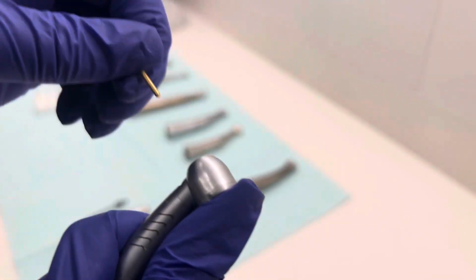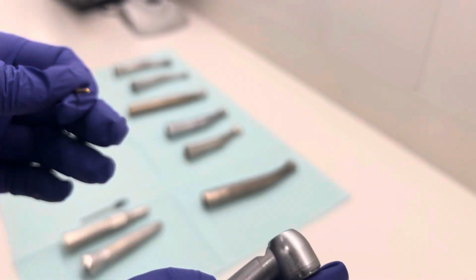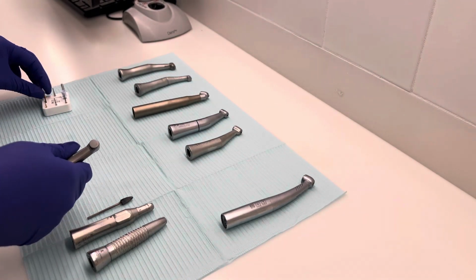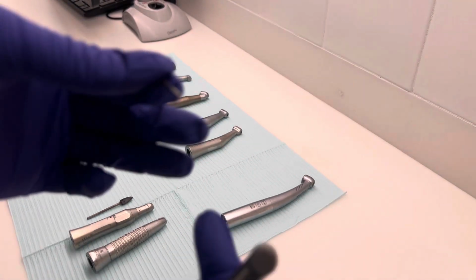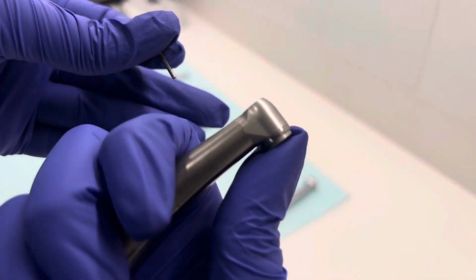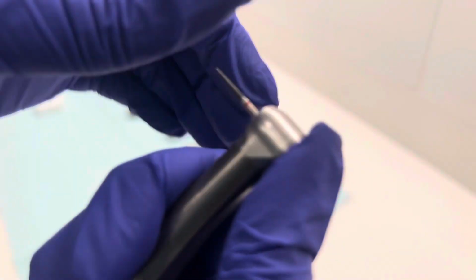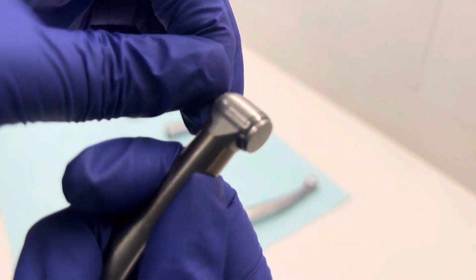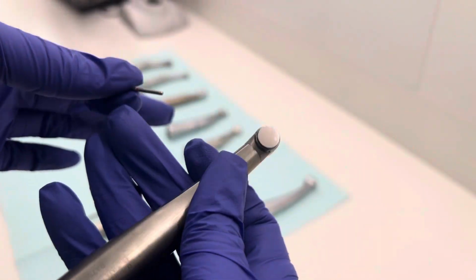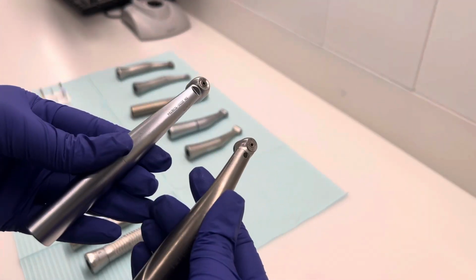The dentist usually does this, but it's a good thing for you to know, because before sterilization, some dentists leave the burrs in the hand pieces and you have to know how to take them out. So that's very helpful. I'm going to demonstrate with another burr. You can see it has a smooth end, doesn't have a latch on it. That's how you know it's very likely used with a high-speed dental hand piece. Same thing, press the back, make sure it's sitting firm, and then pull it out, and all done. Those are easy and pretty straightforward.